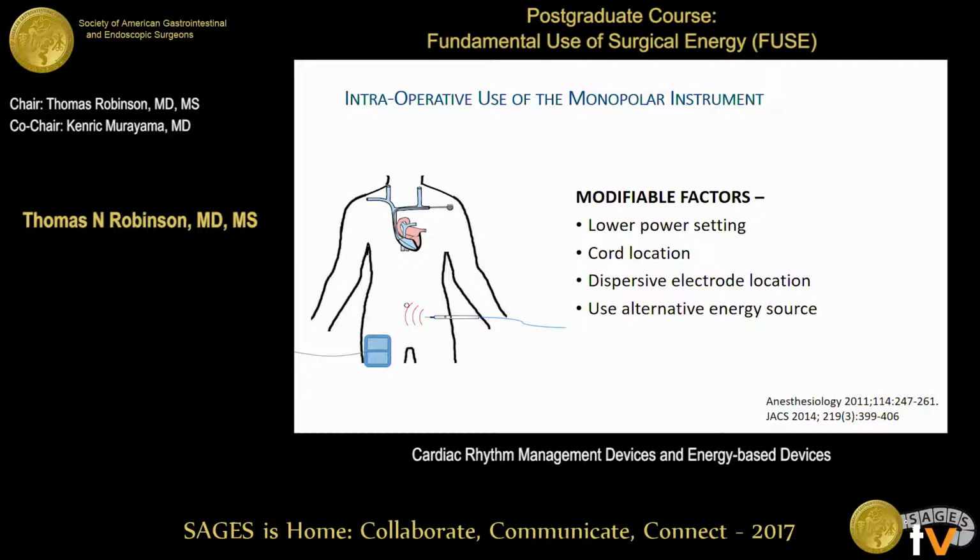It looks like Pascal, you're coming up. Spinal cord stimulator is another big one. I had to do an open emergency bowel resection, and I used bipolar for everything, including the skin and the fascia, and you can do it.